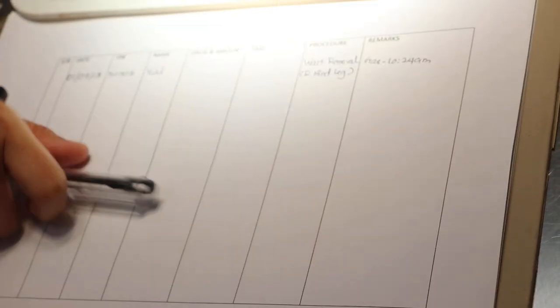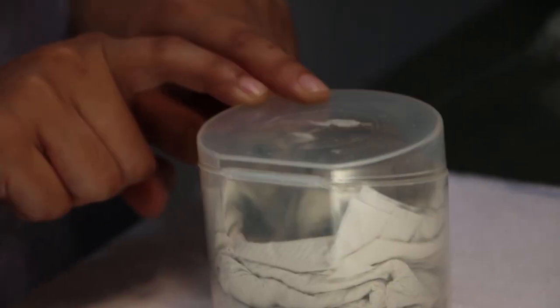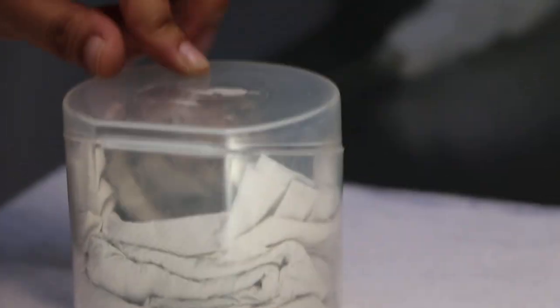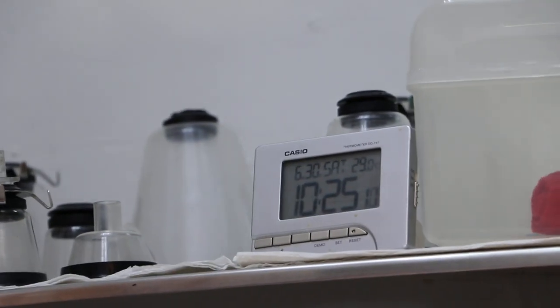We weighed the hamster already. How many grams? 47 grams. So we write down here. Weight is important because sometimes we have to inject drugs and we need to know the weight. Now we go into time of anesthesia, 10:25. So record down here, 10:25.